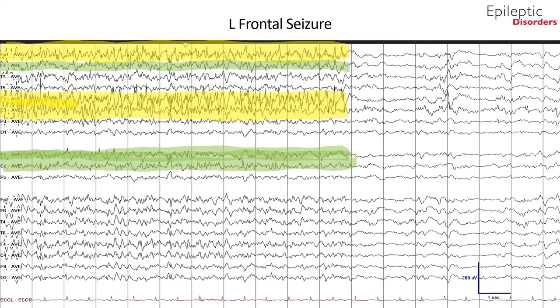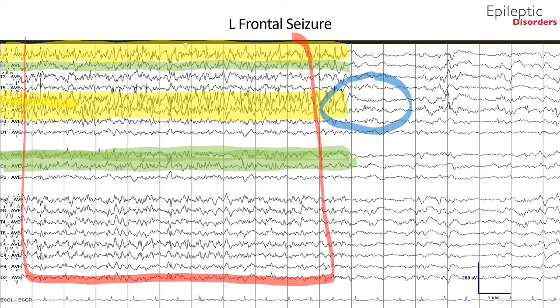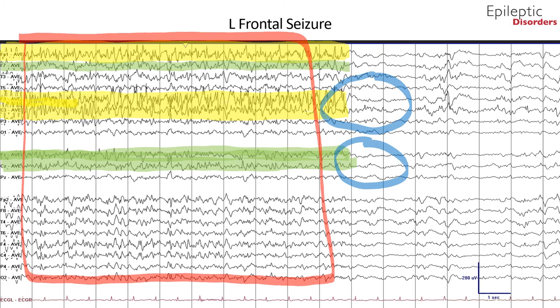In the average montage, the spatiotemporal evolution of the seizure is clearly visible with involvement of F3, C3, and FP1 channels shown in the green highlight, as well as additional spread to adjacent frontal midline FZ, central midline CZ, and F7 with low-amplitude sharps. As the seizure ends, there is post-ictal slowing that is greatest in the left frontal leads, as shown by the blue circles.